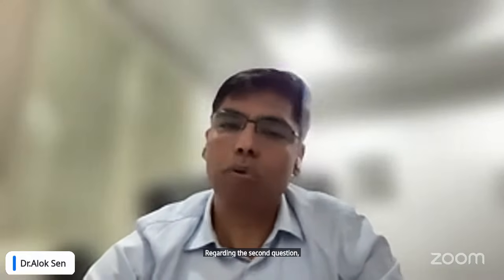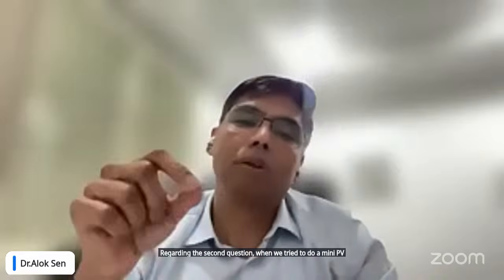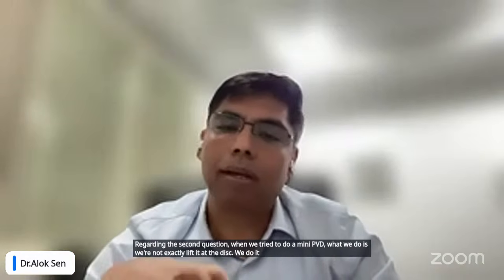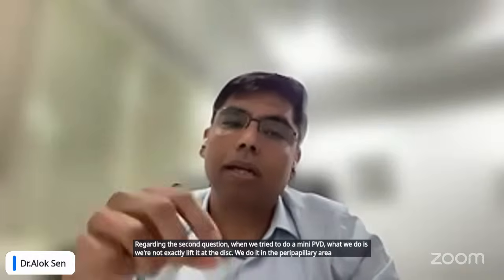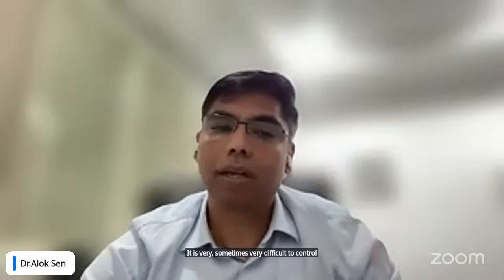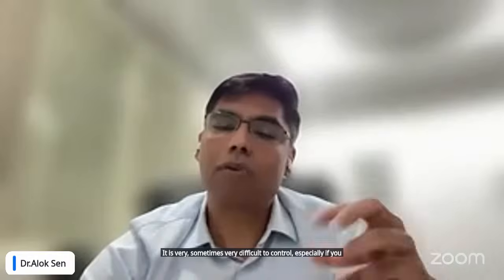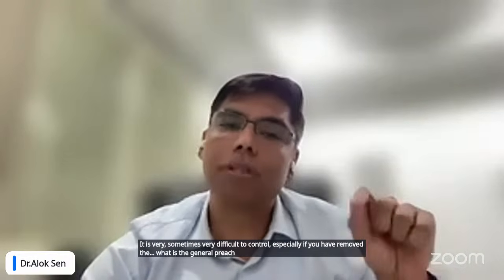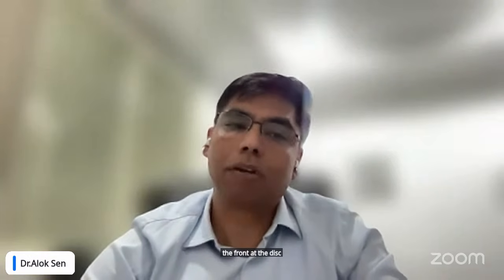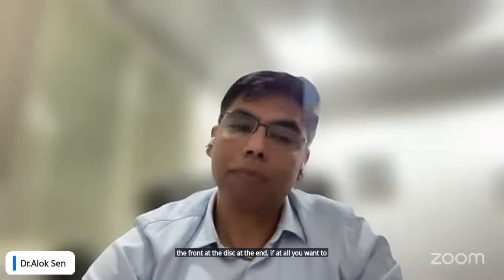Regarding the second question, when we try to do a mini PVD, what we do is we do not exactly lift it at the disc. We do it in the peripapillary area so that we can find a plane. In case there is a bleed, it is sometimes very difficult to control, especially if you remove it. The general teaching is that you remove the fronds at the disc at the end. If at all you want to remove, you can leave it also.